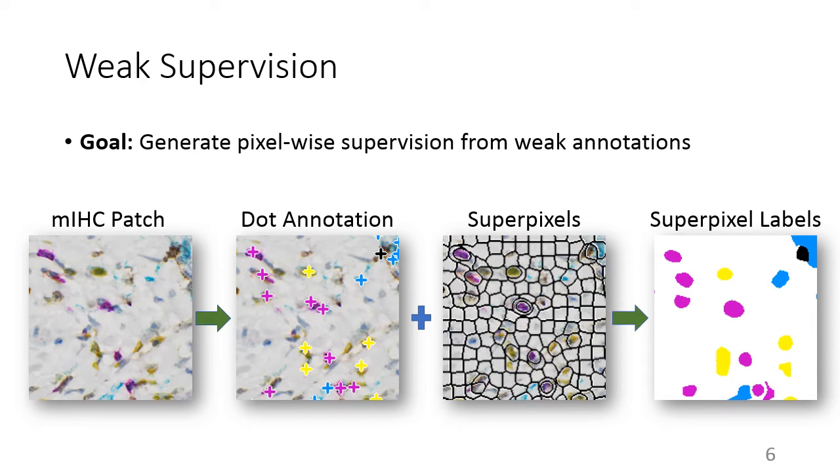Annotating the stain masks is time-consuming and it is practically impossible to get a decent amount of training labels. We need to annotate in a time-efficient manner. Meanwhile, our network needs per-pixel supervision to train. We ask pathologists to dot approximate centers of cells. The dots are expanded to the nearby area using superpixels. The resulting per-pixel label is not exactly accurate, but is a weak form of supervision.